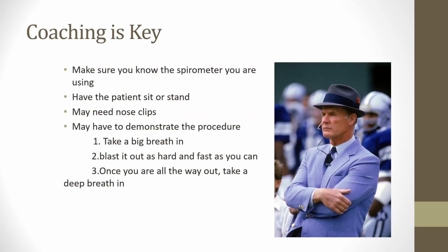Big thing, and I just talked about it, is make sure you know the spirometer that you're using. You need to be a good coach and a good user of your equipment. If the patient gives you great effort, but you did not click start test, or you did not tap something on the screen, I should say nowadays, then you're going to lose that test altogether, and that could have been something that showed their max effort. That could have been a very valuable diagnostic and therapeutic tool for that patient. So make sure you know the spirometer, make sure you played with it or are familiar with it anyway.